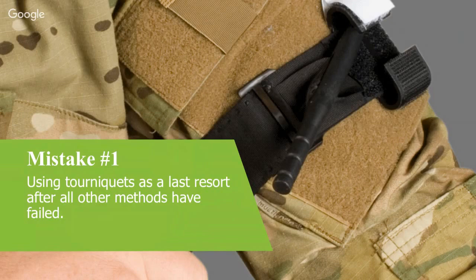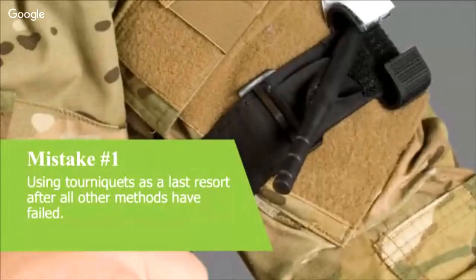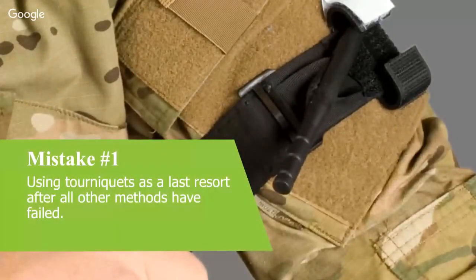Yeah, certainly. It's interesting looking at that poll with about 60% of the audience having never applied a tourniquet in real time, and that's understandable. It's not something that's terribly common outside of the combat environment, and it's hard to know what you should put a tourniquet on and what you might be able to control with direct pressure unless you've seen a lot of this sort of thing. Looking at Paul's question there, are these mistakes something you see across the globe or just where we're at? Across the globe, Paul. Both Jez and I have had the opportunity to train and operate with operators from all nationalities in multiple countries, and we do see these recurring themes.